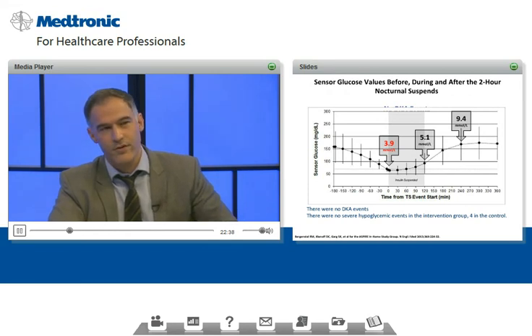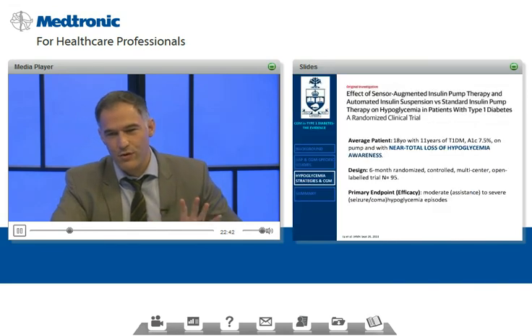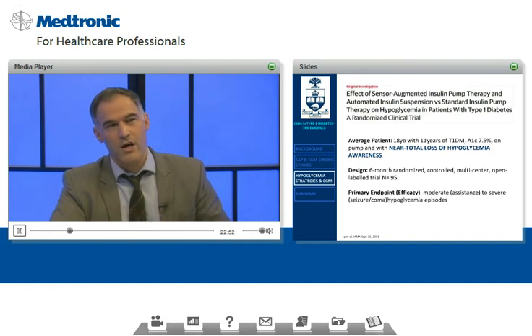All right, and then my very last study that I think would round out your knowledge. If you know just these studies, you know everything around CGM, and that is what we can refer to as the LY study. The primary author was LY, L-Y, an Australian study, which was the exact same concept, the same devices, but here the average patient was completely different.